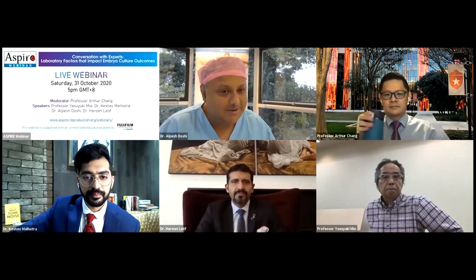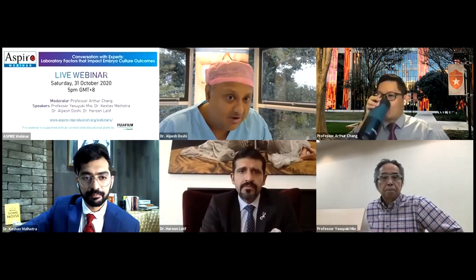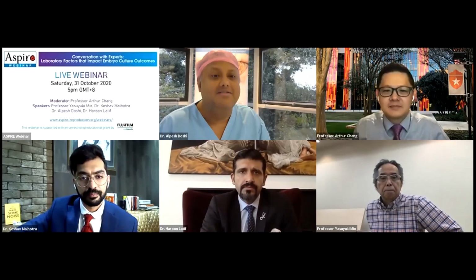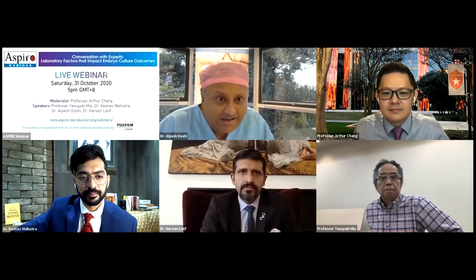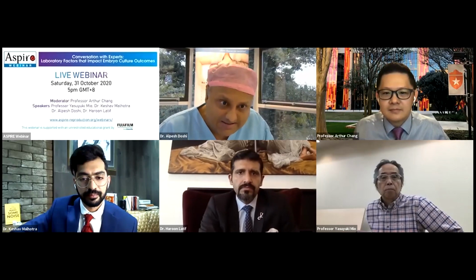So biopsying the trophectoderm, is it giving us an accurate indication of what the embryos are doing? Are we throwing away healthy embryos? And the answer is yes. In my opinion, I think we are throwing away healthy embryos. However, technically, it is very difficult to biopsy the inner cell mass.